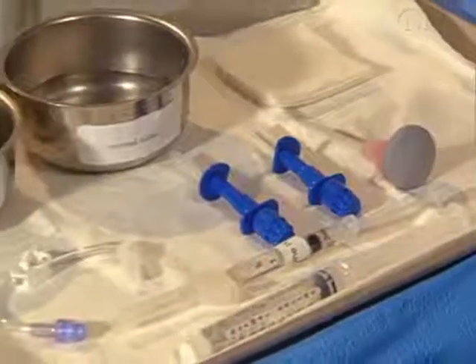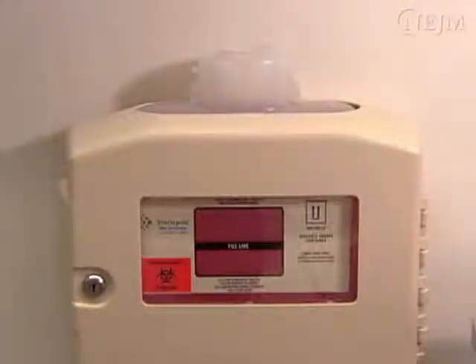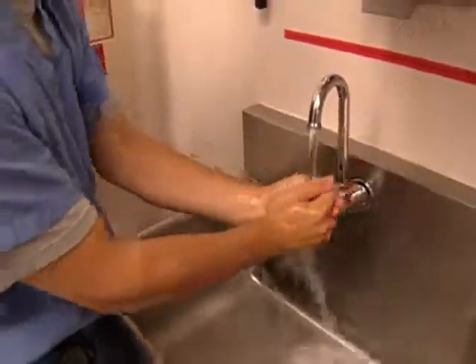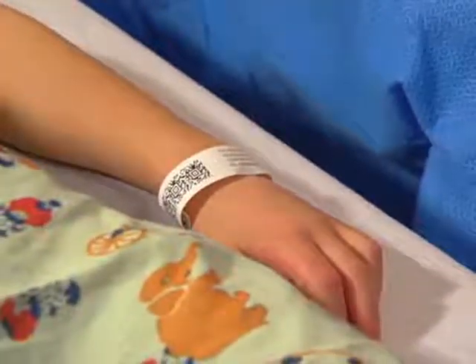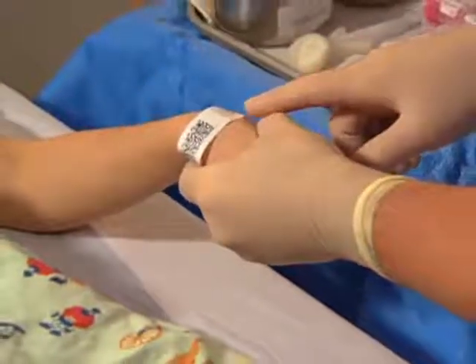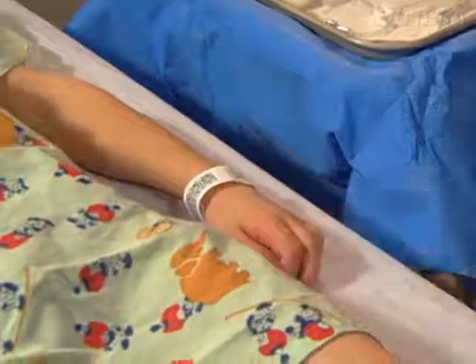Place all equipment on an open surface that is readily accessible. Make sure that approved biohazard sharps receptacles are nearby, since intraosseous cannulas are not equipped with retractable safety needles. Follow standard precautions. Wash your hands prior to any contact with the patient. Whenever possible, identify the patient using 2 identifiers, such as name and date of birth, before beginning the procedure and whenever a procedural timeout is initiated.